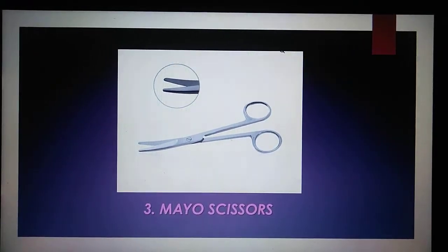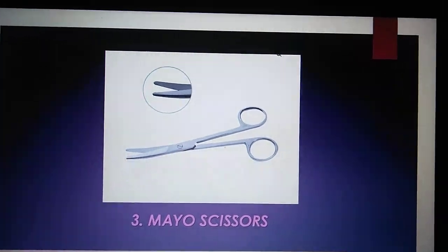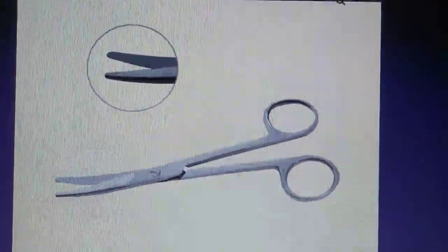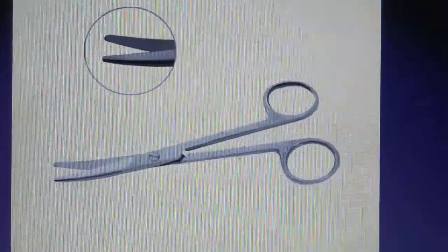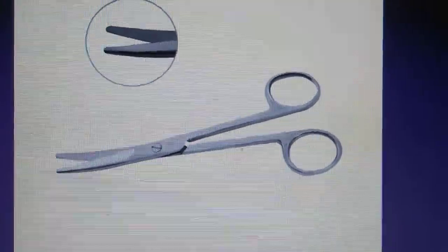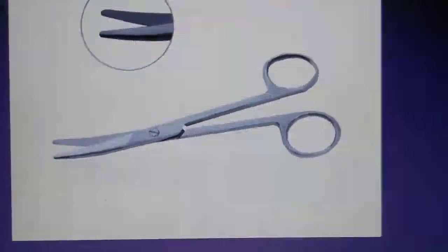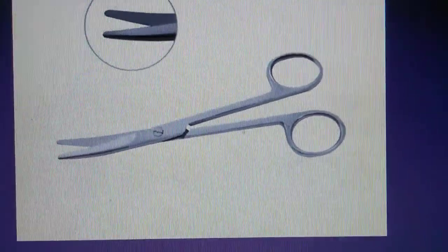The third one is the Mayo Scissors. Mayo Scissors are available as straight or curved, and in a variety of lengths. They have a standard bevel blade. The curved instrument is most commonly utilized for cutting or dissecting dense or deep tissue, and the straight version is typically used for cutting surface tissue or sutures. Both straight and curved Mayo Scissors can be used interchangeably depending on procedure and physician preference.